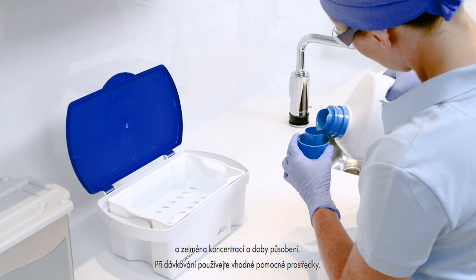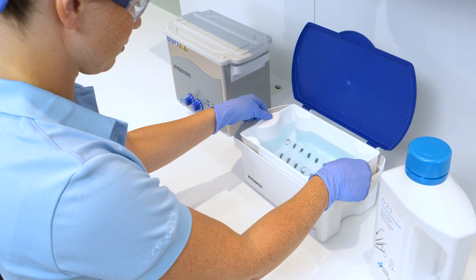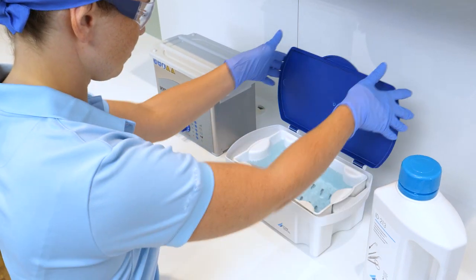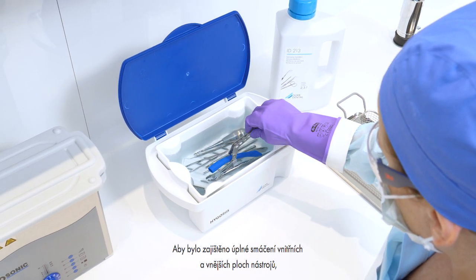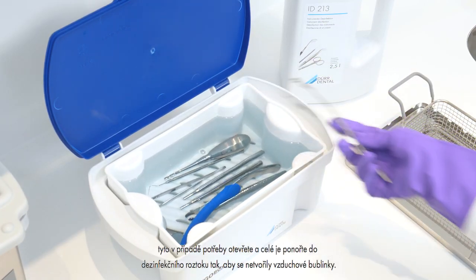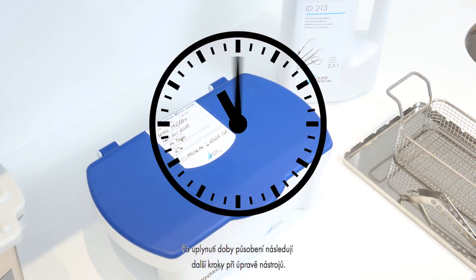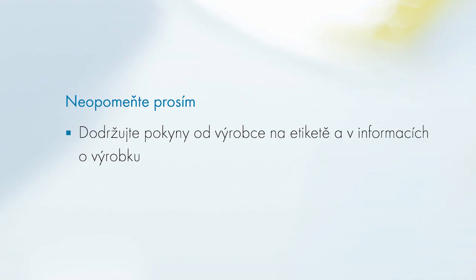Always use an appropriate dosing feeder for dosing. To ensure complete wetting of the inside and outside surfaces of the instruments, open the instruments and immerse them completely in the disinfection solution without air bubbles. The further instrument reprocessing steps follow the expiry of the exposure time. Always read the manufacturer information on the label and in the product information before use, and note the exposure times of the cleaning agent.